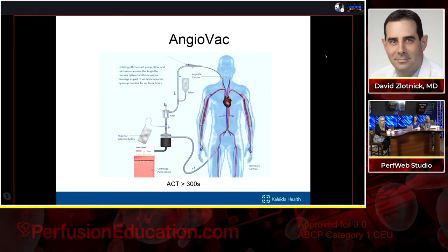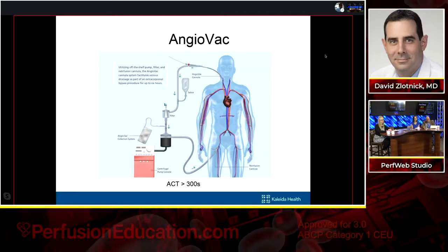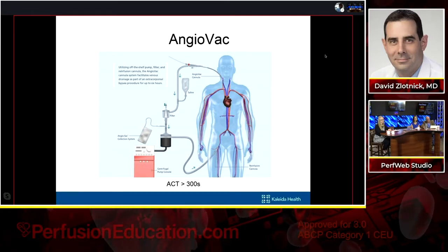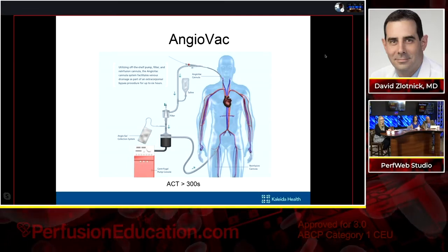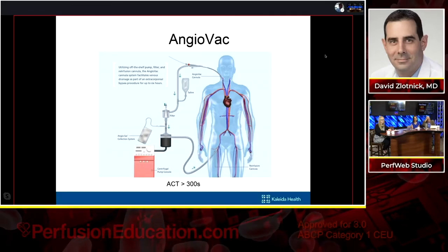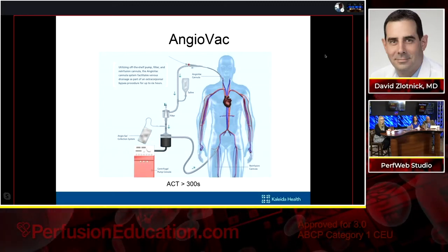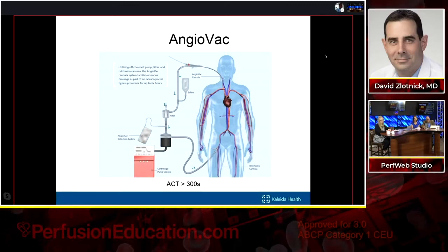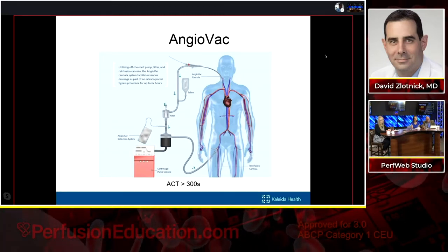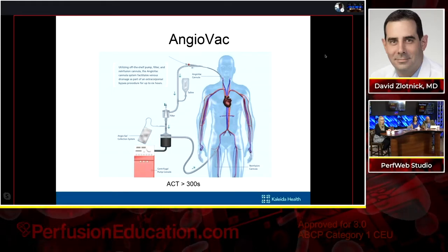So this is the crux of how we think about these cases: to have this as our starting point, figure out where we're going after and what our access sites are going to be. We've recently done our first LV case. I don't want to get too involved in that, but in order for us to have suction aspiration from the left ventricle to maintain stability while we're dropping the cardiac output, we had to actually do AA access, so return the blood through the femoral arterial system to maintain stability. But for the majority, 99% of cases, venous-venous access is going to be where we're going.